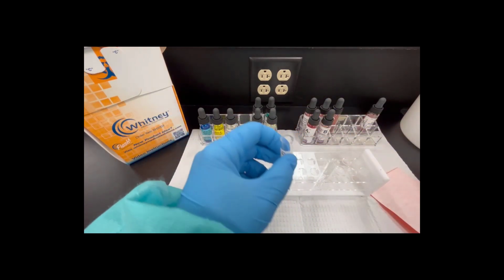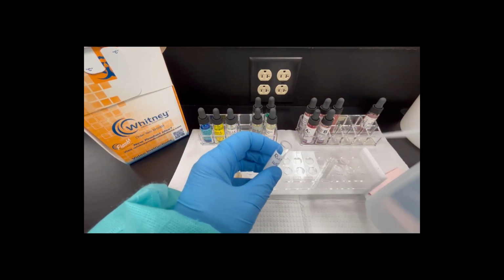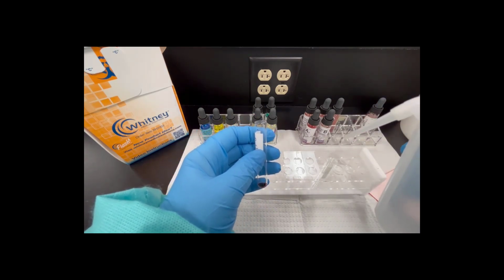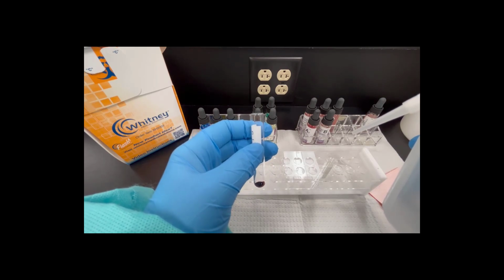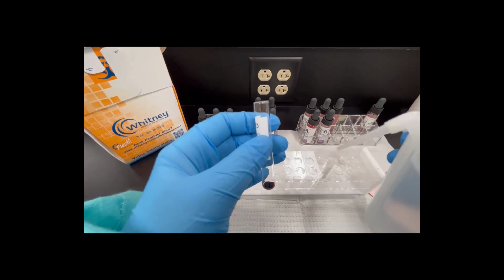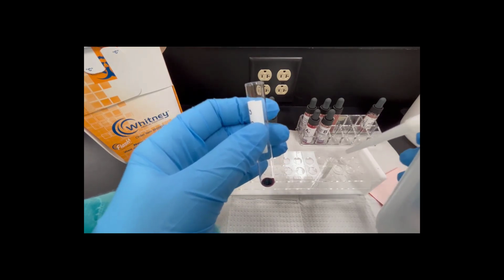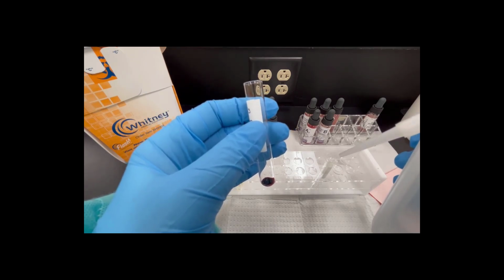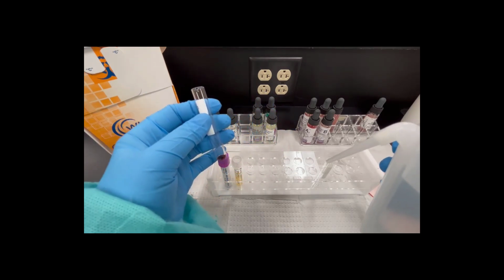So now I'm going to take this and grab my bottle of saline and forcibly squirt my saline into the bottom of this. When I'm squirting, I want to hear this psh sound because I want to hear those cells tumbling around like in a washing machine, because what we're doing is washing away all the fibrinogen, the plasma proteins, all the things that are blocking the binding sites on those cells. So when we put our antisera with them, we're good to go.